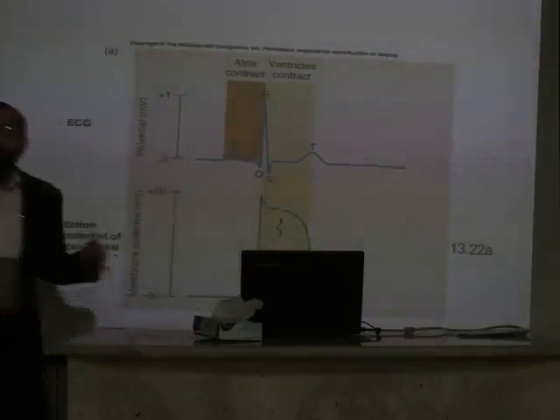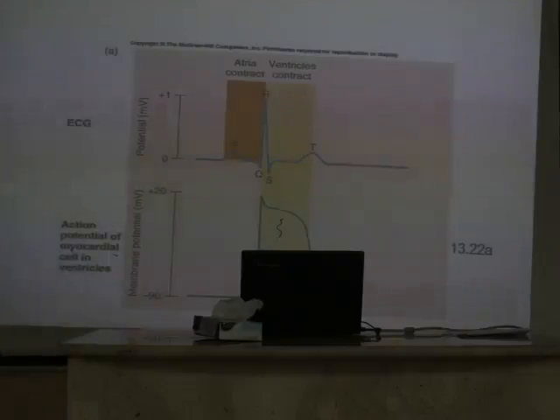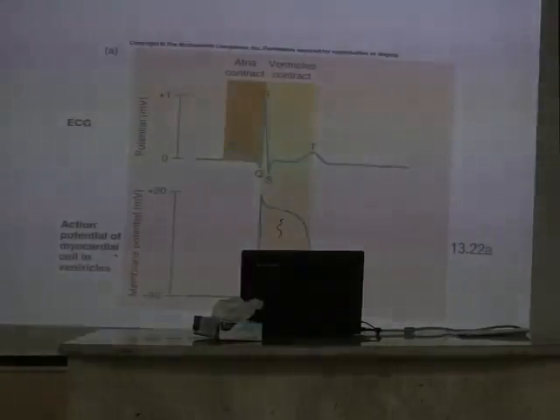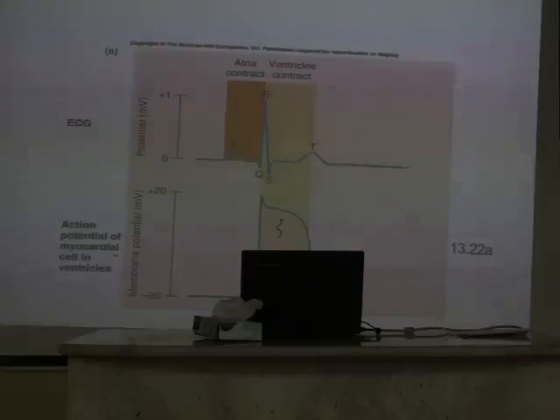Now you see, in a normal ECG strip, how many ECG complexes are there? How many waves do you see here? Four. Identify and count. How many? Four? Five. Look at it again, no problem. Okay, you might miss something. Five. All of you agree on five waves? Yes. Right?